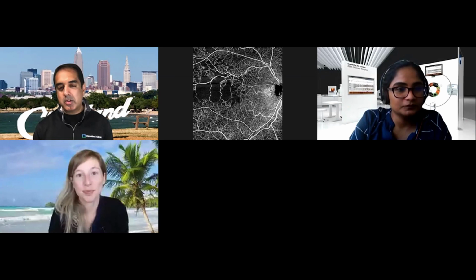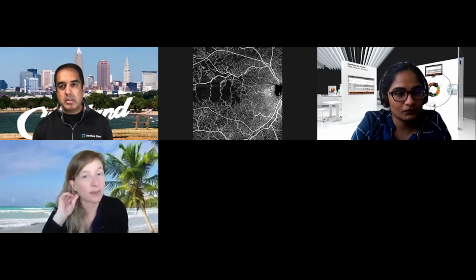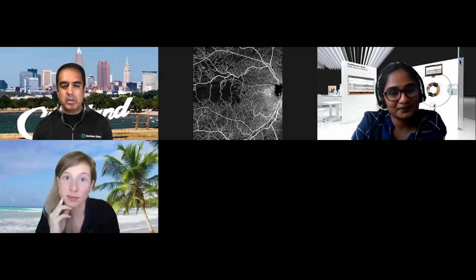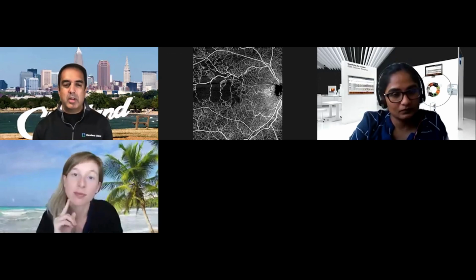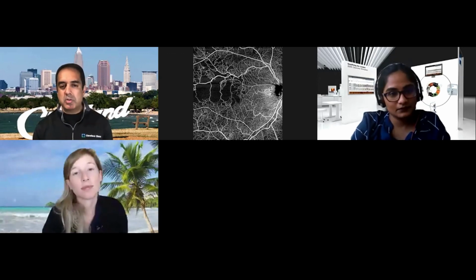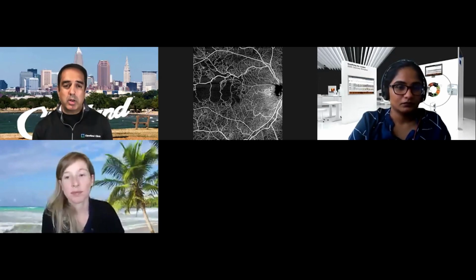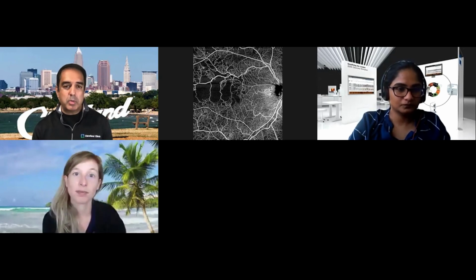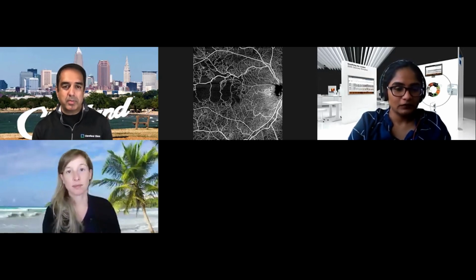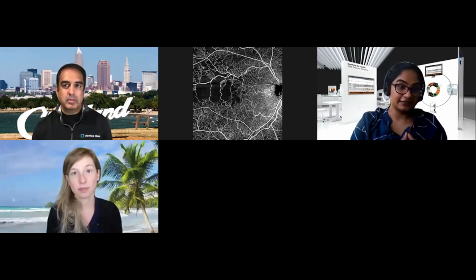That's great. And tell me about the data sets you have. One of the concerns might be that for these deep neural networks, when you build these networks, they take into account males versus females, maybe African Americans versus Caucasians or other races, and even across the world. How does this work? Do you have to get data sets from all of those countries, or how does this work for developing these algorithms? Ideally, we need to get some diversity in the data set.